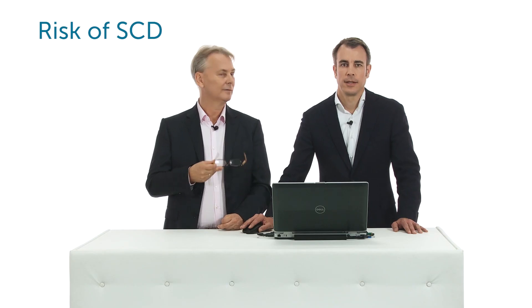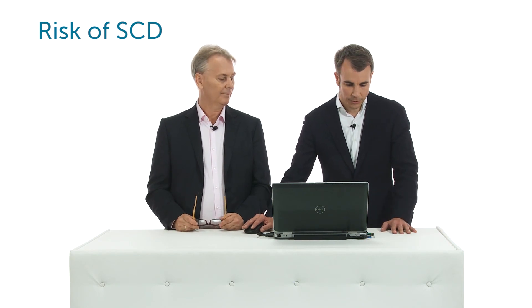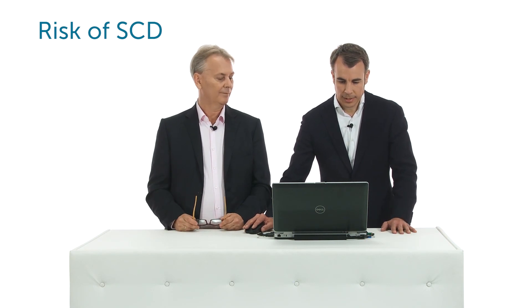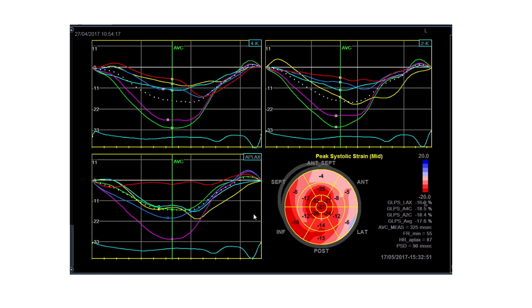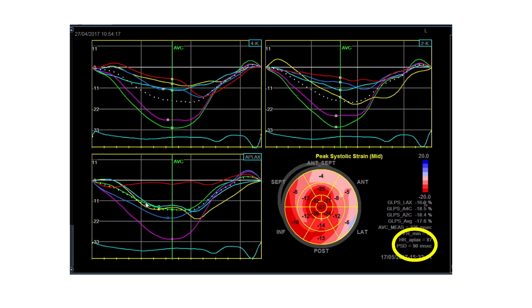But in this case, can you say something about the risk of sudden death? Not directly, but we can look at the curves once again, and this program tells us the dispersion—and this means how asynchronous is the contraction of the left ventricle. You can see that this dispersion in this case is 90 milliseconds, and this is a highly pathological value. We know from some studies that the higher the dispersion is, the more likely the patient is to suffer from ventricular arrhythmias or even from sudden cardiac death.